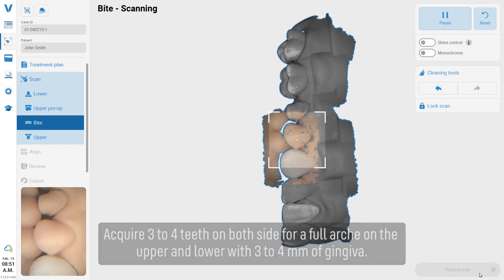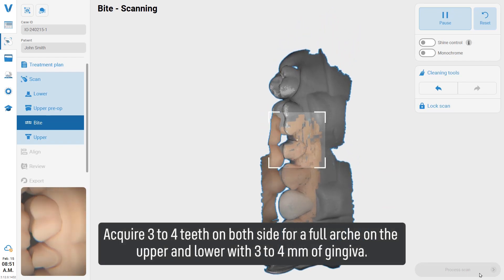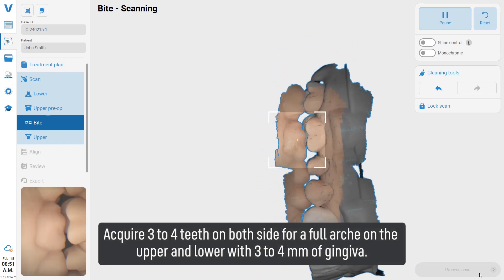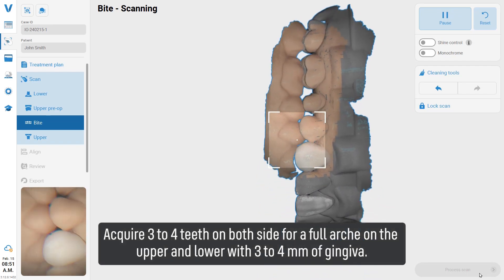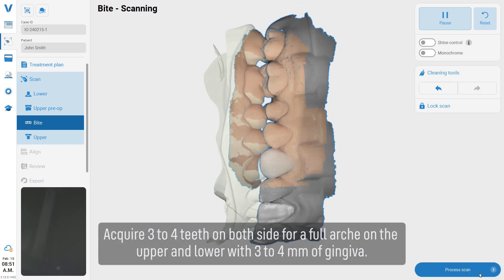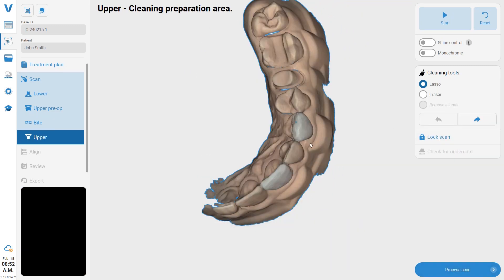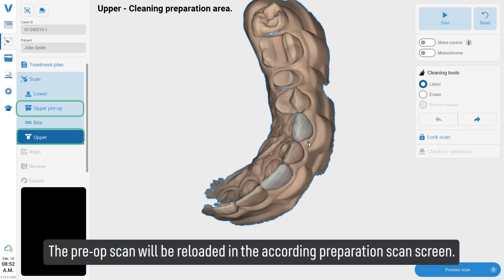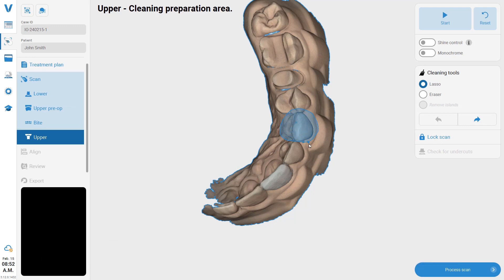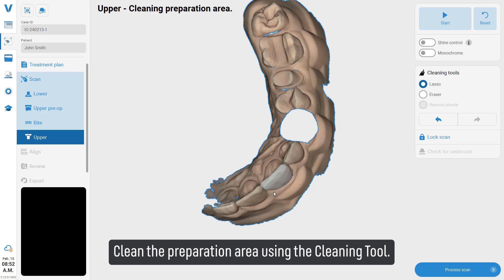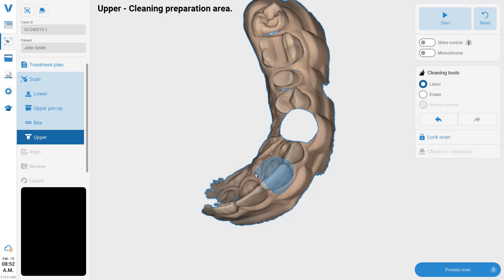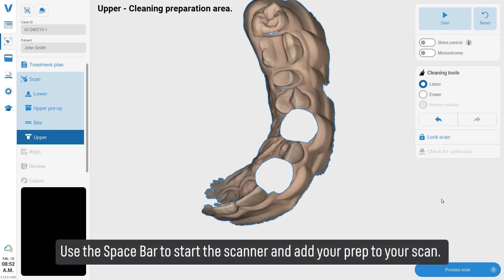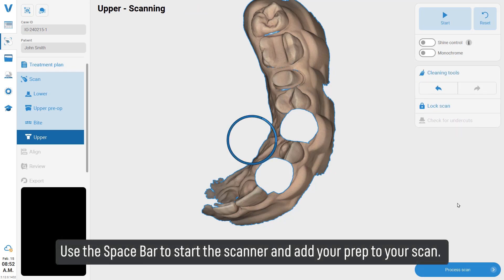Acquire three to four teeth on both sides for a full arch on the upper and lower, with three to four millimeters of gingiva. The pre-op scan will be reloaded in the corresponding preparation scan screen. Clean the preparation area using the cleaning tool. Use the space bar to start the scanner and add your prep to your scan.